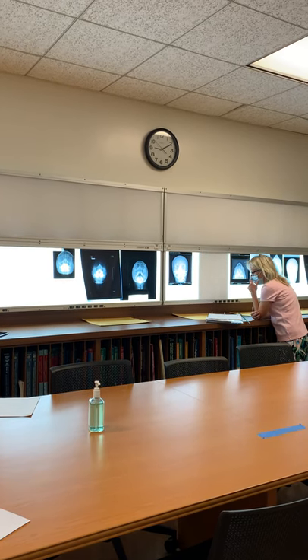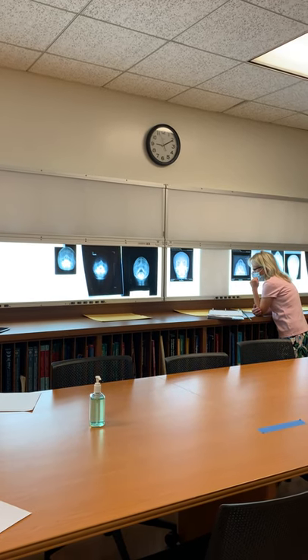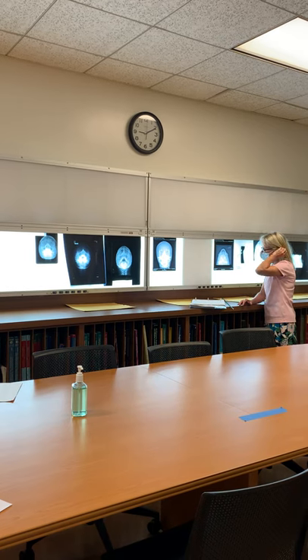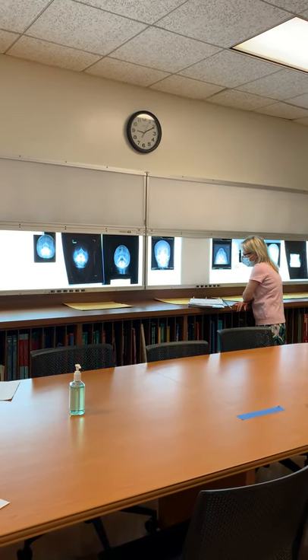For rotation, just like the Caldwell, measure from the lateral side of the orbit to the lateral side of the skull. It should be equidistant, just like the PA Caldwell. For tilt, just like the Caldwell, the petrous ridges should be in one horizontal plane.